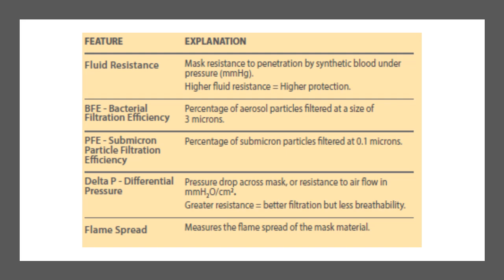Second is the bacterial filtration efficiency, which is the ability of the mask to filter aerosol particles of size less than 3 microns. Third one is the particle filtration efficiency, which is more relevant to viruses, which usually form a size of about 0.1 microns along with the fluid.